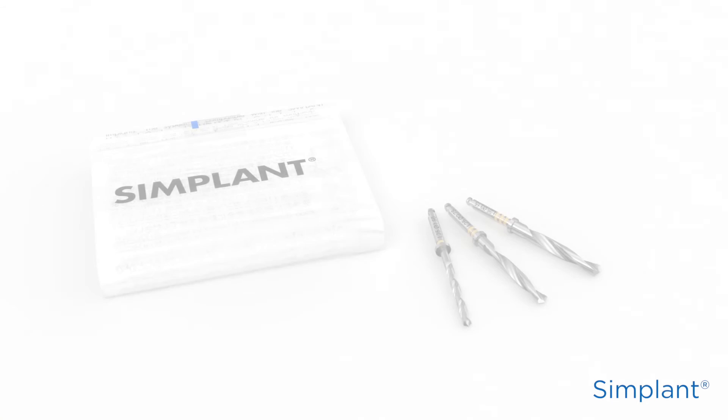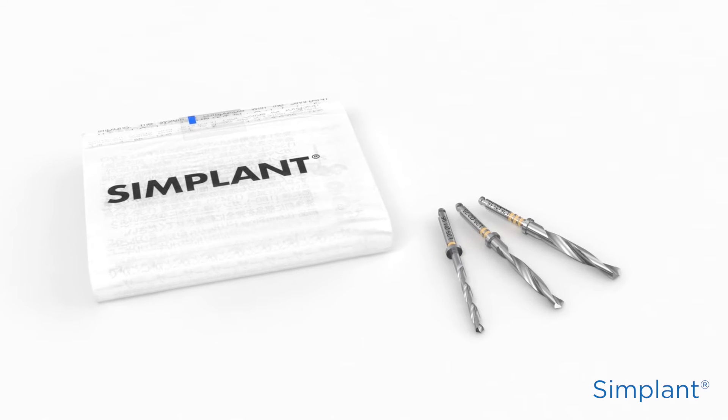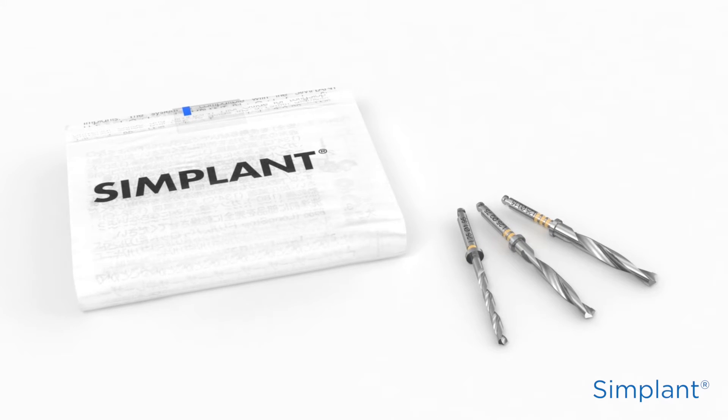Now that you've sterilized the Simplant Guide, you can sterilize all additional components according to their individual directions for use. Now, you need to check the fit and stability of the guide before surgery.